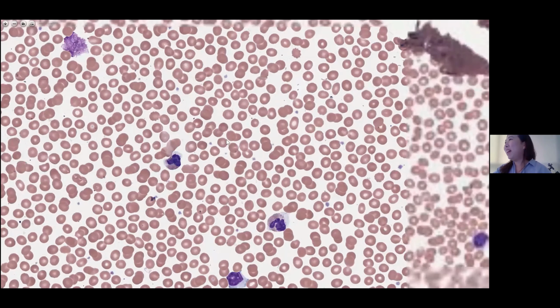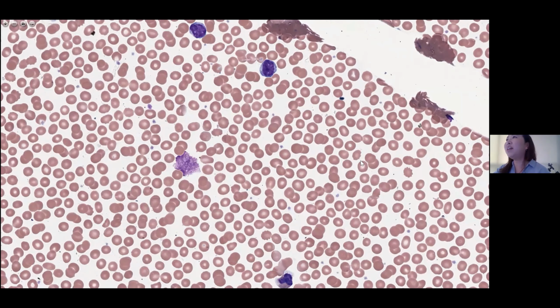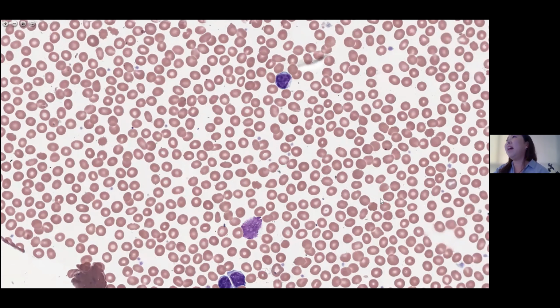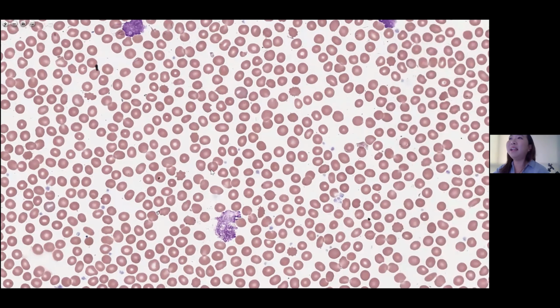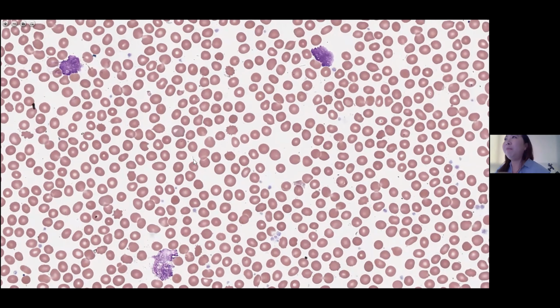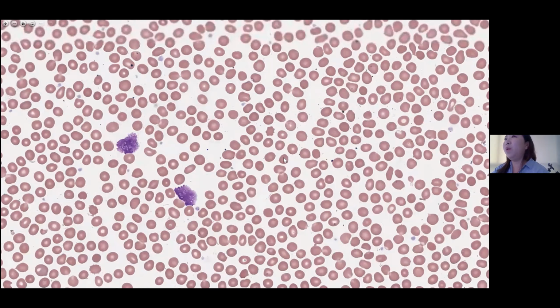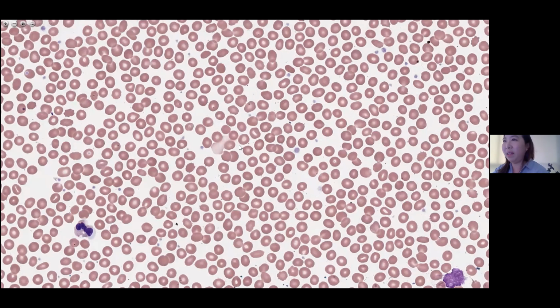So, okay. Otherwise, the platelets look good. The red cells look unremarkable. There's no evidence of hemolysis. So in CLL, sometimes, and we'll talk a bit more about this disorder, I prepared some PowerPoint slides in a moment, but sometimes it can be associated with hemolytic anemia, more specifically autoimmune hemolytic anemia.